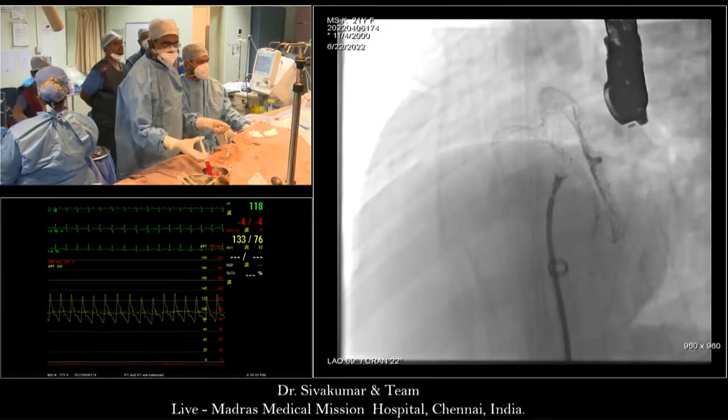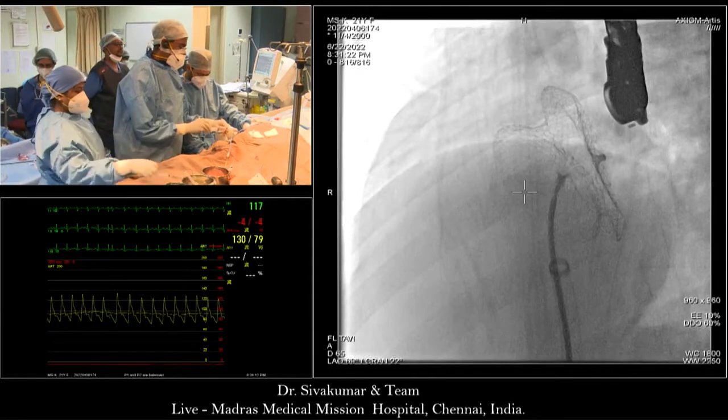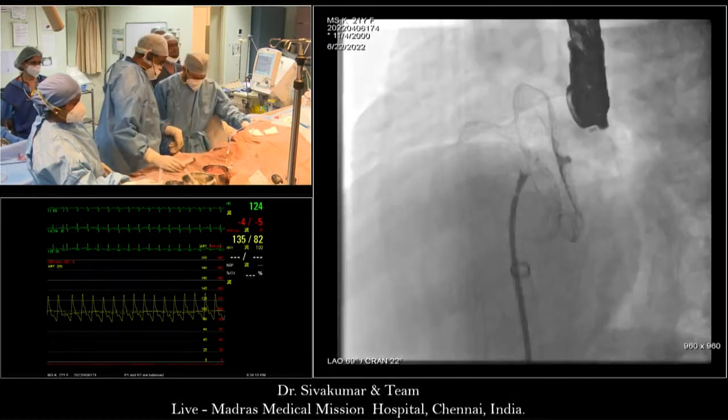Okay. So most people are saying the waist is not fully formed yet. Siva, what do you mean? If the waist is constrained still, then you may have oversized the device. The device needs to be touching the mitral valve. No, forget the mitral valve, that is a separate issue.